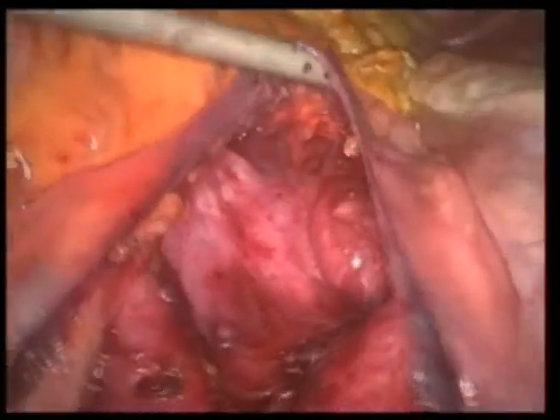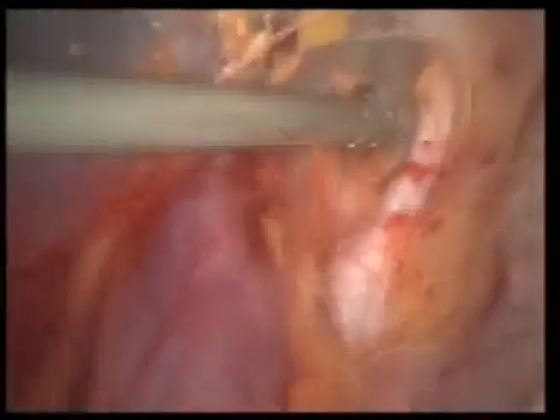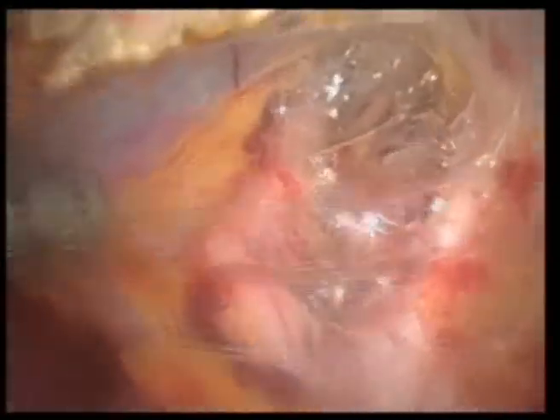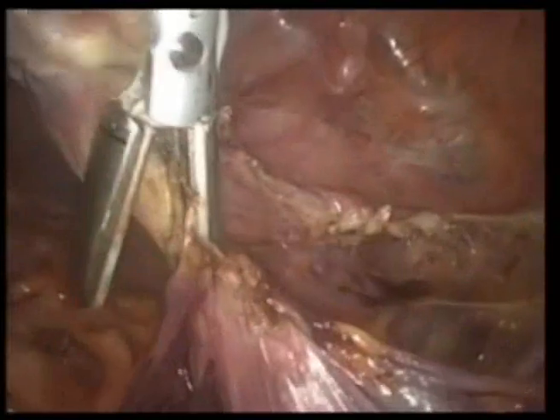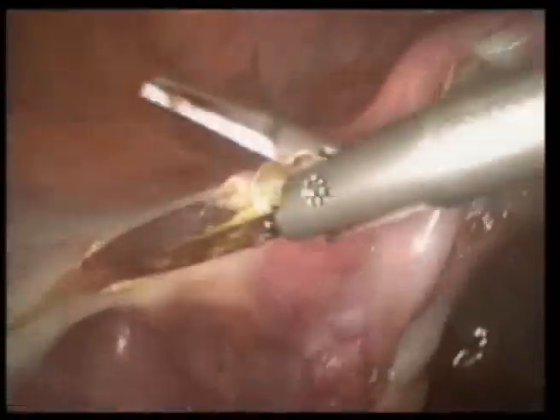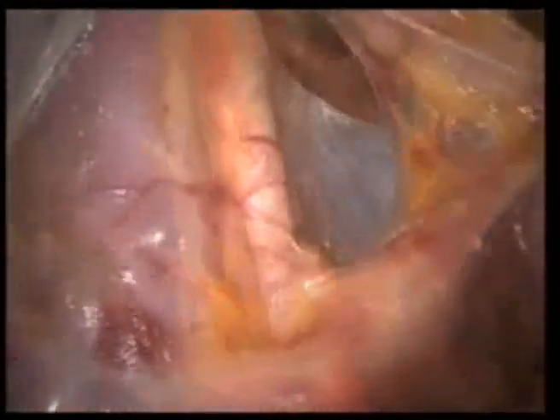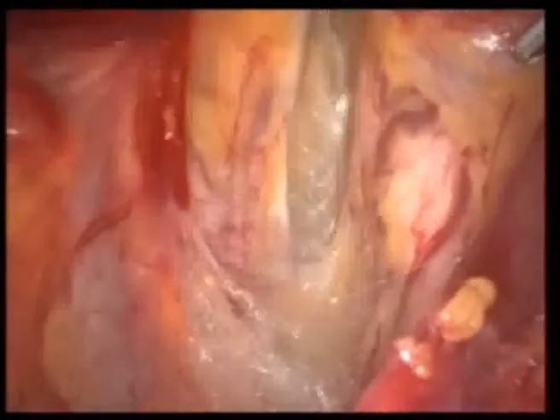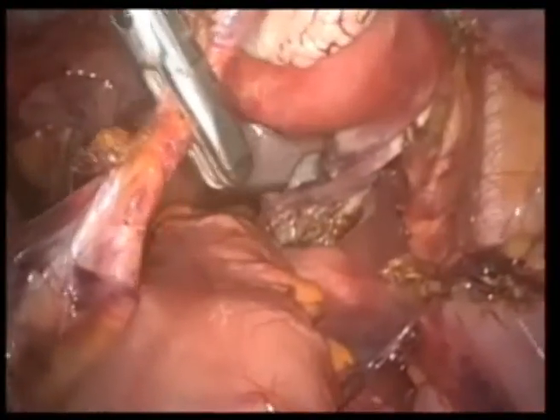This is an excellent demonstration of the middle sacral vein coming from the left common iliac vein. Attention is then turned to the pelvis, where dissection of the right infundibulopelvic ligament is commenced. The right ureter is identified and seen peristalsing here. The harmonic shears are used to make a window beneath the right IP ligament to facilitate its transection. On the left, the broad ligament is opened and the pelvic sidewall is opened. A similar dissection occurs on the left, with identification of the left ureter on the medial aspect of the broad ligament, seen peristalsing here. Thus, the left IP ligament can be transected safely utilizing the ligature device.